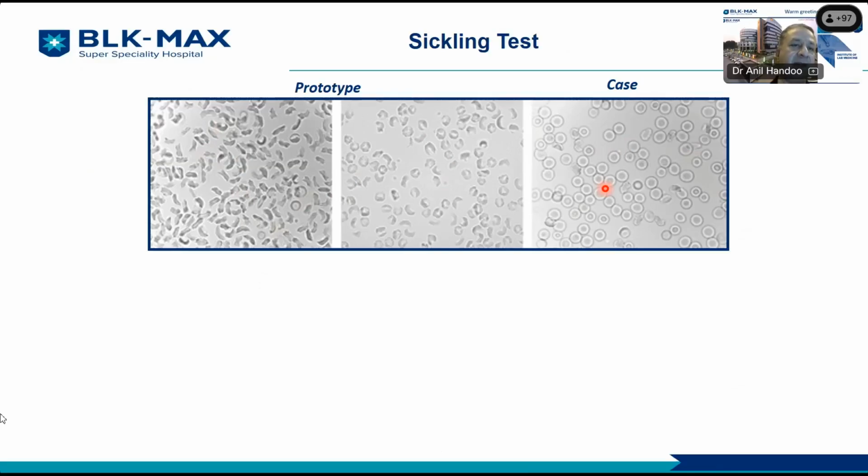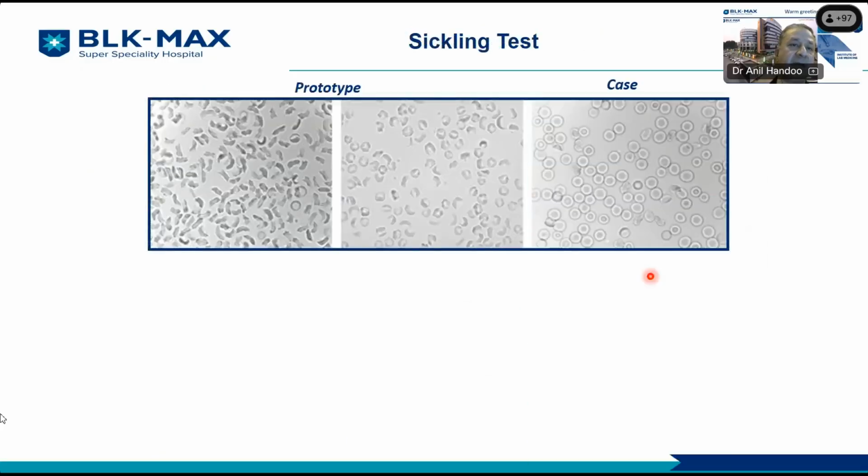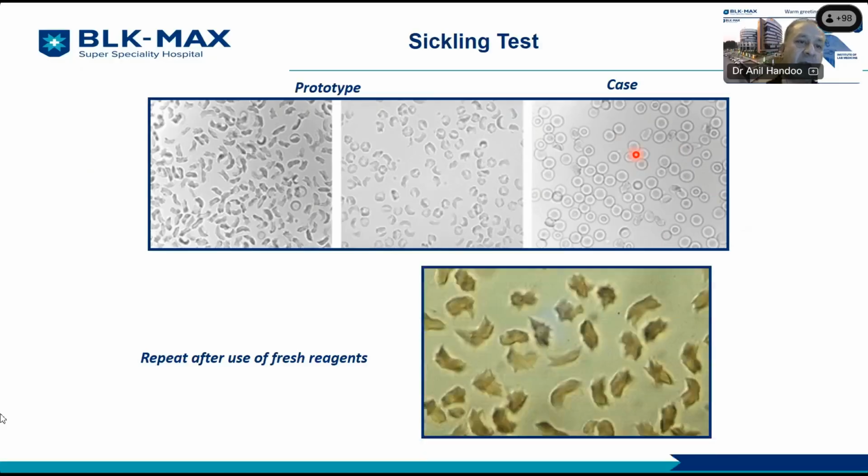But this didn't explain anything, because if we go back and see, we had classical sickle cells in this case, yet we were not able to get the sickle cells or the sickling in our patient sample. So we were kind of foxed as to what to do next. So we decided, okay, let's just take it up, review and see where we've gone wrong. So we used a fresh set of reagents again. And now when we used the reagents, we were able to get the very classical sickling that we were expecting.